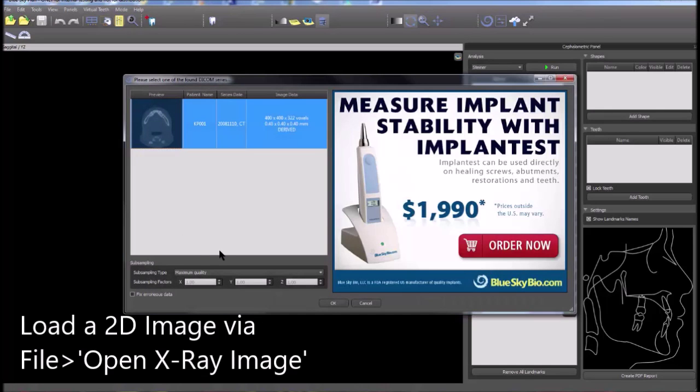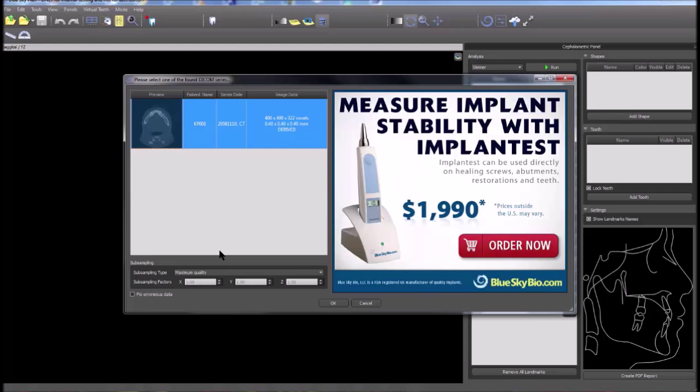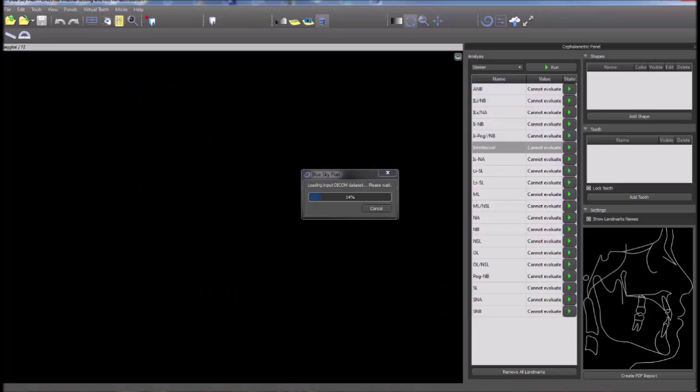After locating and selecting the relevant DICOM folder, click OK. If necessary, choose a series or just click OK.